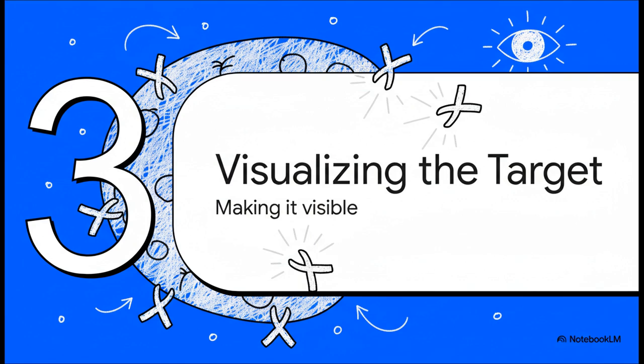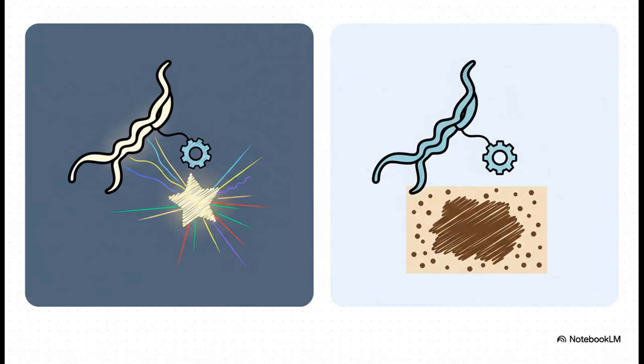Well, this brings us to the systems we use to make these molecular interactions visible to our own eyes. There are really two main ways to go about this. The first is called immunofluorescence. Here, you tag the antibody with a molecule that literally glows when you hit it with a certain wavelength of light. The second method is chromogenic. In this case, you link your antibody to an enzyme that starts a chemical reaction, which then deposits a stable, colored material right on the target.